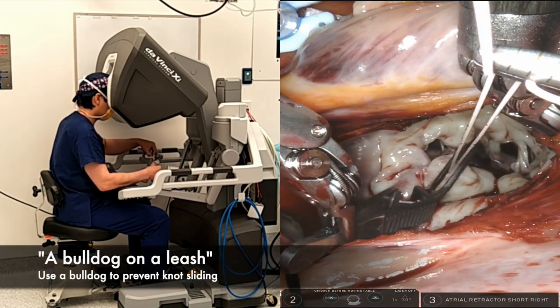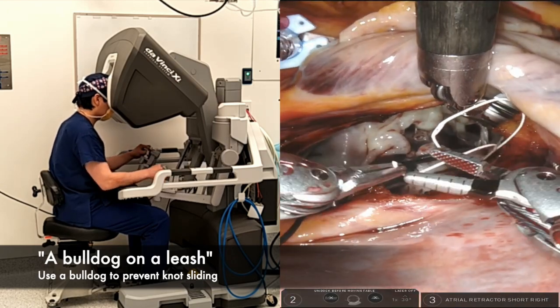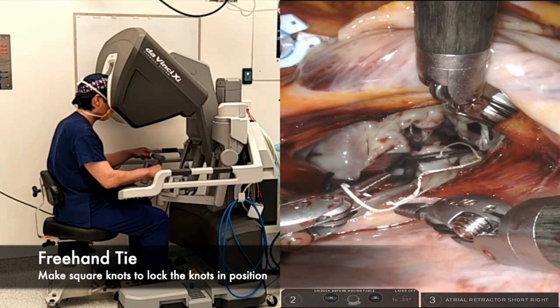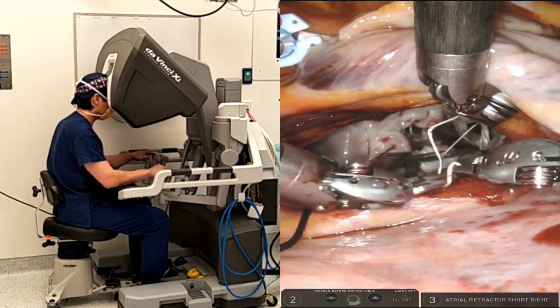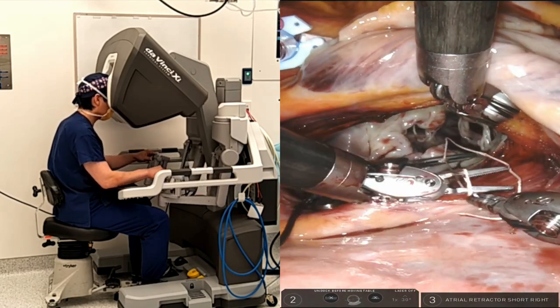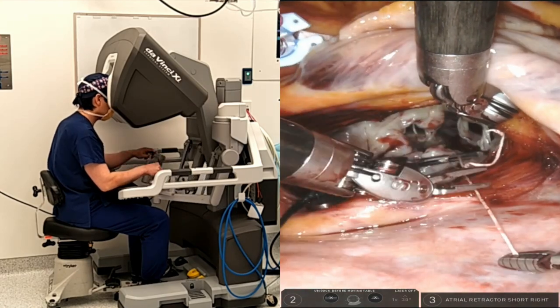Step 3: I then use a vascular bulldog clip to prevent knots sliding down while I tie the two ends of the strings together. When you tie knots, try to avoid excessive stretching on either side of the atriotomy incision. For a Gore-Tex suture, I generally make eight to ten knots including a couple of square knots to prevent slipping.